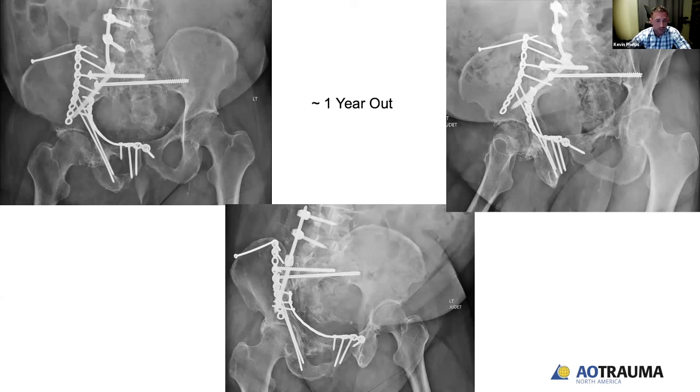He's got a little bit of arthritis in his hip, but his hip doesn't really bother him. It's actually his plateau that's really driving his outcome on his right leg because his plateau was pretty bad. But if you look closely at these images, it looks like he has broken his iliac bolt from its attachment on the rod. And so my spine partner is planning to take out his hardware sometime in the near future. Is his sacrum united? I think it is. I think it is united. I haven't repeated his CT scan, but he's not really having any pain around his hip or pelvis. He's got some weakness, but otherwise I'm not really having any discomfort.